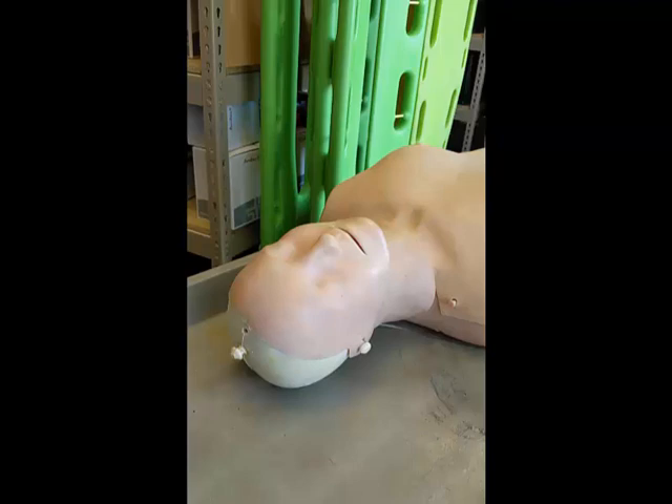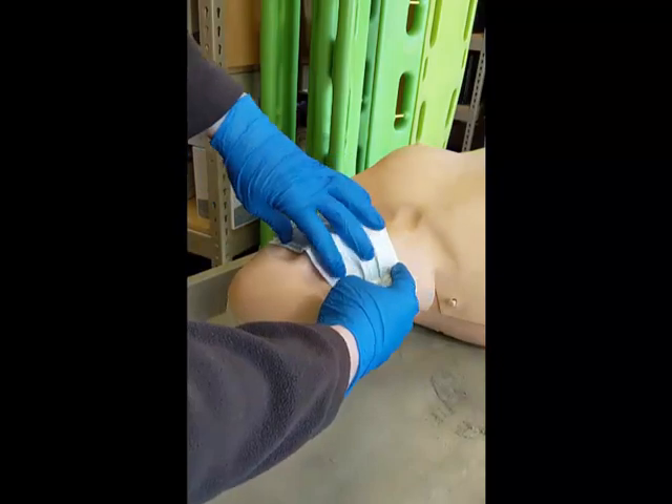The runner will go in with either the AED or the LifePak 15, and also be sure to have a surgical mask available. As soon as the runner makes first patient contact, they will determine that the patient is in cardiac arrest and immediately place a surgical mask over the patient's face.